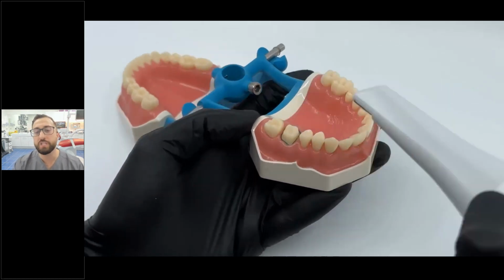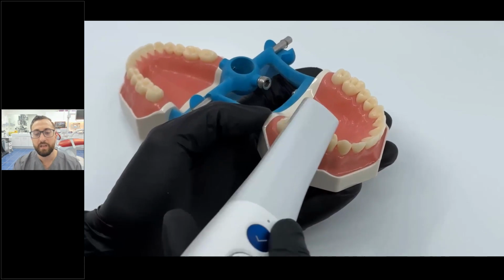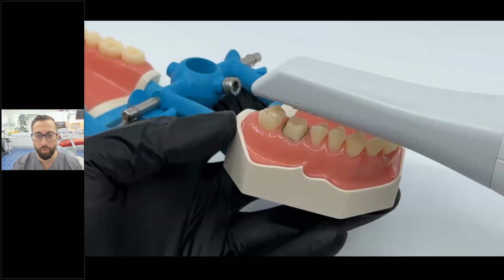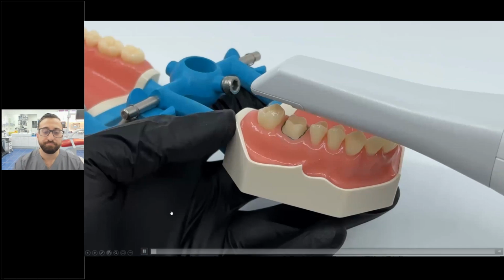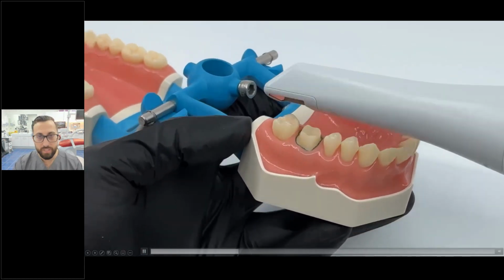And when you get good at doing this, you can easily take a full arch scan within 60 seconds using modern scanners. This shouldn't be something that takes 5 minutes or more. And here's another video here. This shows a quadrant scan, occlusal first, rotate, rotate.